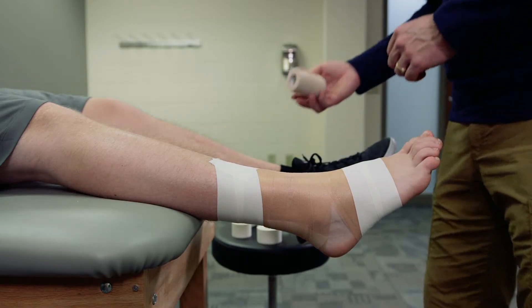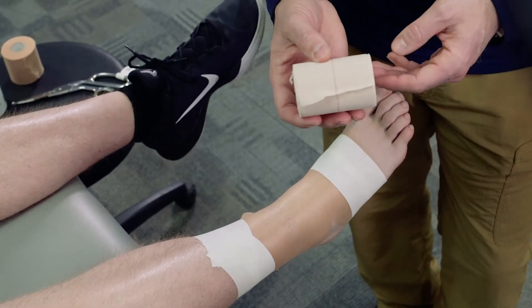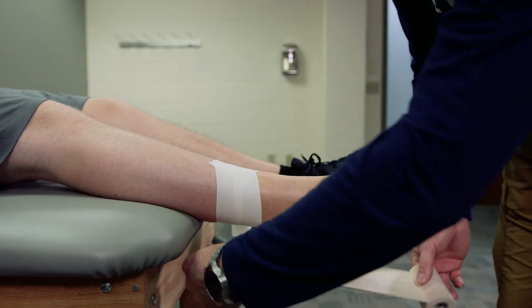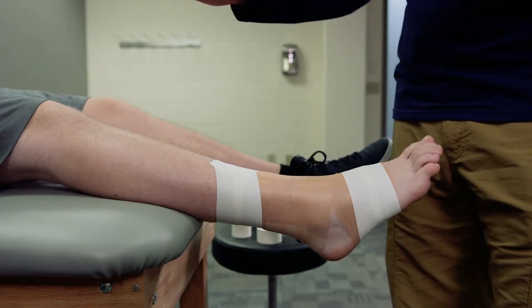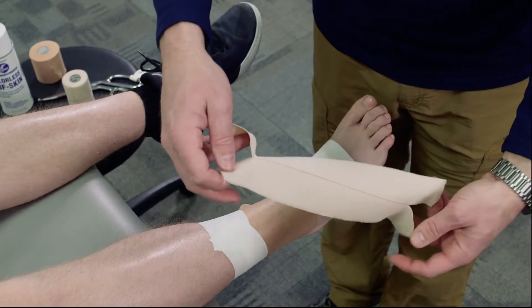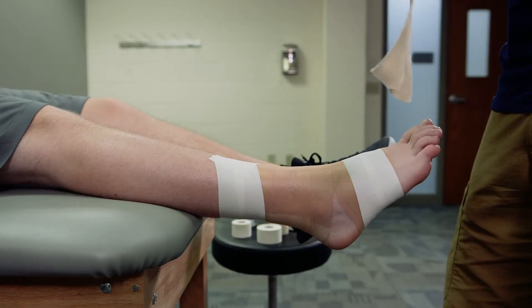Now that the anchors are done, we're going to use some elastic bandage tape. It's sticky on one side but allows stretching — this is called Elasticon, though there are many different options you can use. I'm going to measure from the base of the calf down to the foot anchor, getting a piece about 15 inches in length. Once I have that piece pre-cut, I'll take my scissors and cut two small strips into the bandage so I can secure it onto the leg.